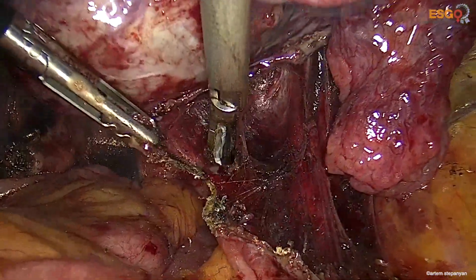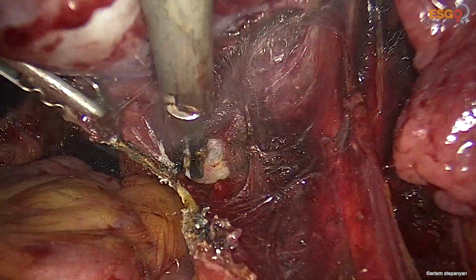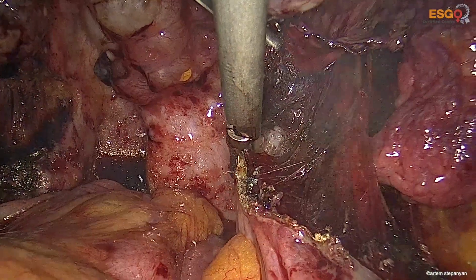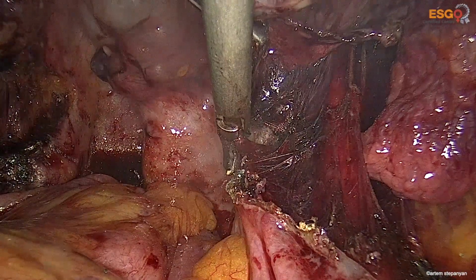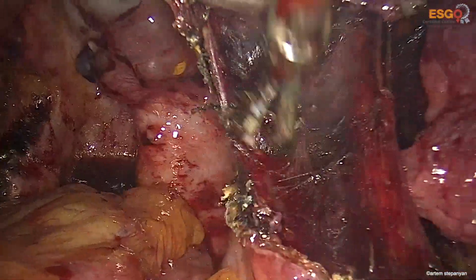And we do this dissection gradually, and at the same time we're attempting to dissect any anatomical structures attached to the peritoneum to be removed.